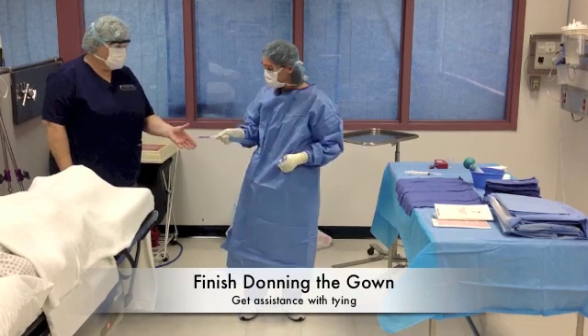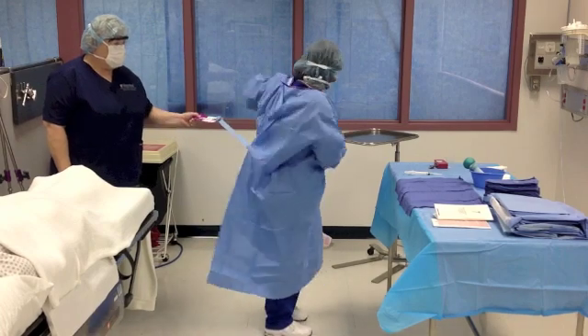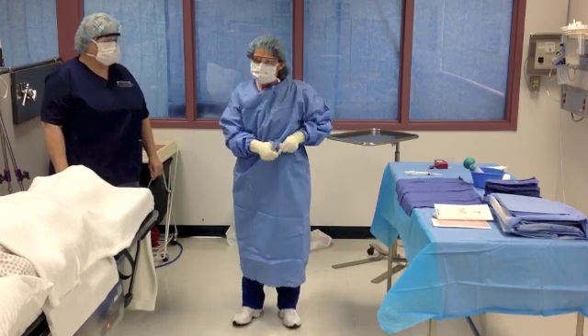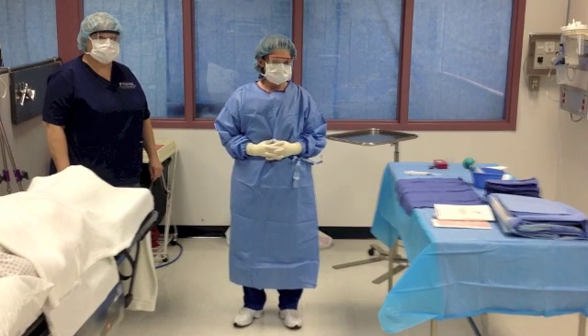Turn and face the circulator, being careful that you do not turn your back to the sterile field. Grasp the tag with your right hand and the tie on the left side with your left hand. Pull the tag on the left side out with your left hand while still keeping hold of the tag in your right hand. Extend the tag to the circulator, making sure your hand is on the back end of the tag. Once the circulator has a firm grip, release the tag and turn in a counter-clockwise motion one full turn. Transfer the left tie to the right hand, then grasp the long tie with your left hand. Pull the tie from the tag and tie the strings in a bow.